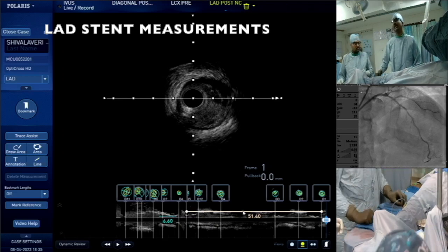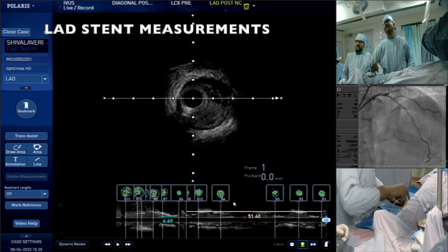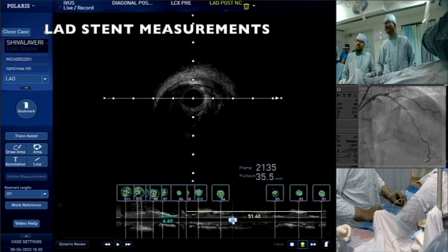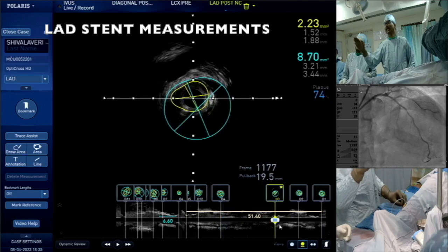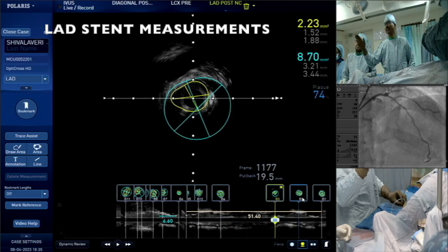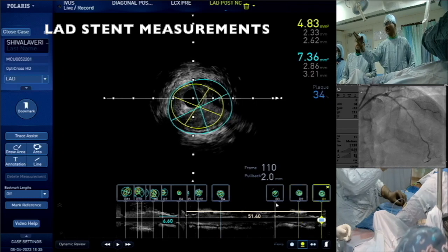Just give me, right. But is there any landing zone in the middle? Yeah, because we can see some landing zone in the middle. There is a block, and we can go down here. Go down. At B3 there is some landing zone. B3. What is the block area here? Okay. B2. What is the block area here? Yeah, less than 50%, around 50%. So I can use that, right? Yeah. So B1. Okay. So I think that's fine. So B2 can be my landing zone.